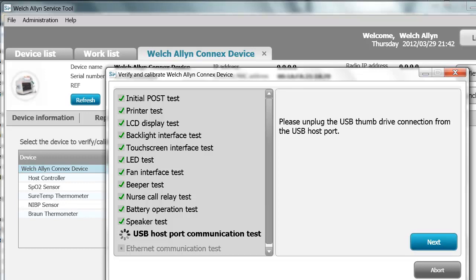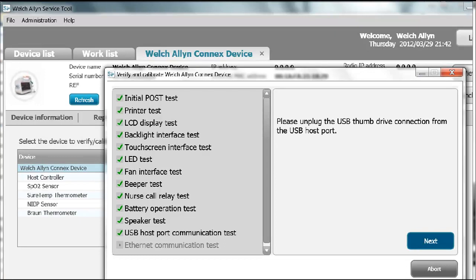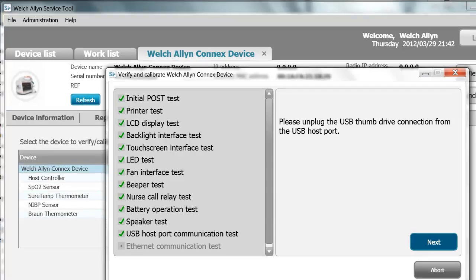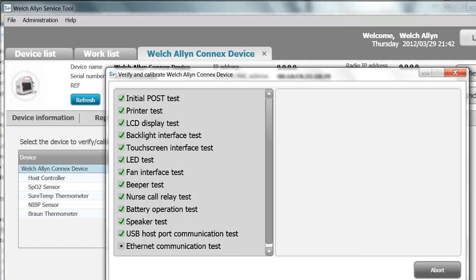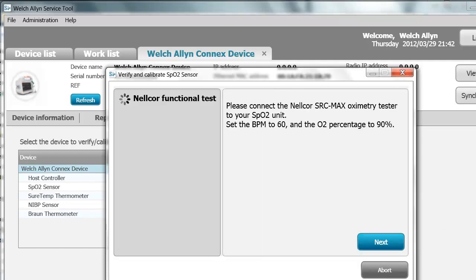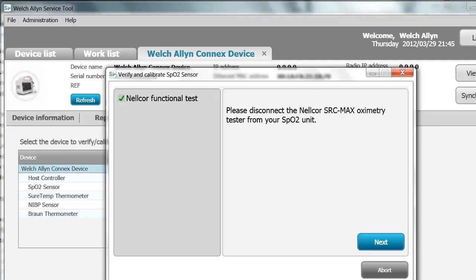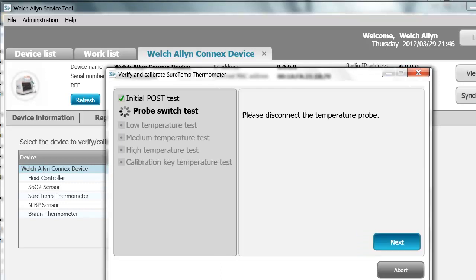Note that a full calibration tests the full device, whereas a calibration check or accuracy check does not check the full system. The next test is the Ethernet communication test. If you do not have a radio or use Ethernet, you can skip this test. Click Skip. Next, the SPO2 sensor — the Nelcor functional test. On the full calibration, you must use the Nelcor SRC Max because the service tool talks to this device and reads the results from it. Set the BPM to 60 and the O2 percentage to 90. For a full calibration of the device, you must use the SRC Max to pass the test.